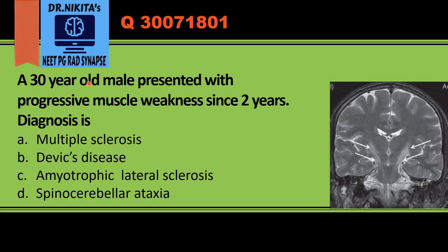A 30-year-old male presented with progressive muscle weakness since two years. What is the diagnosis? First of all, here we see that this is an MRI because the bone is black. This is a T2-weighted MRI because the CSF in the lateral ventricles and sulcal spaces is white.